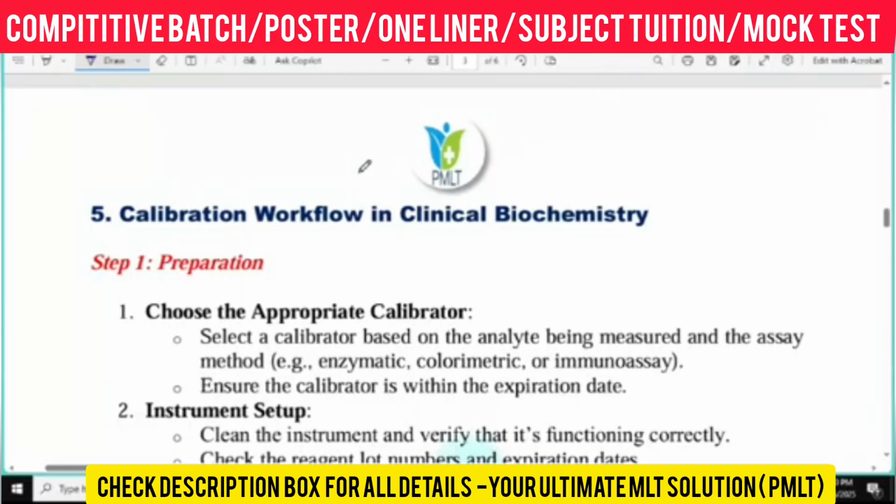Sir, what is the main function of calibration? Teaching the machine. Okay, how to teach, how to run. Without running the calibration, your machine will not learn how to do the action.